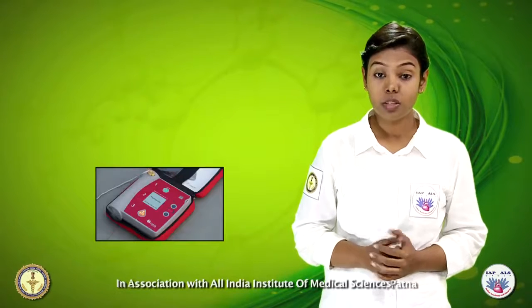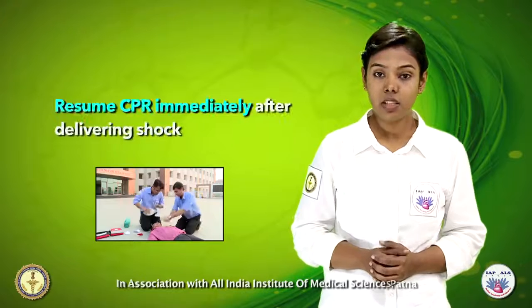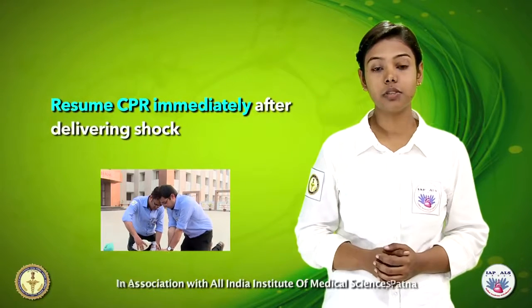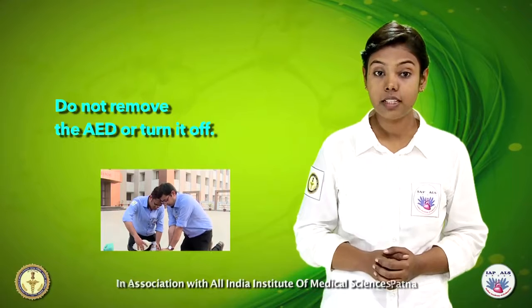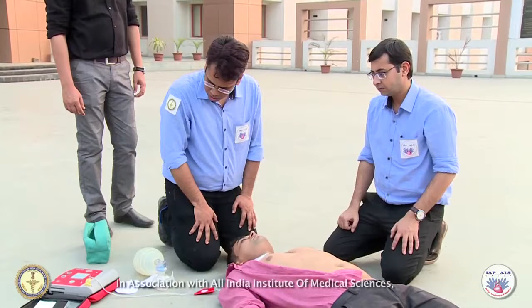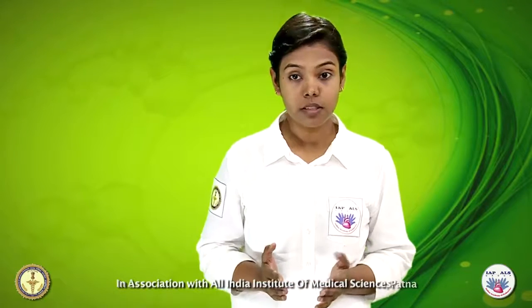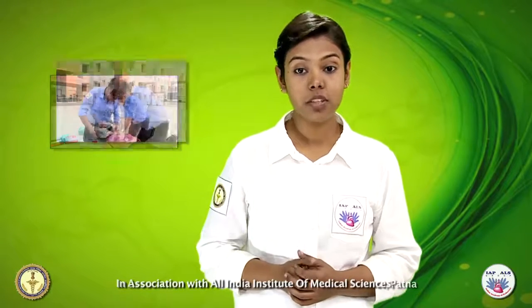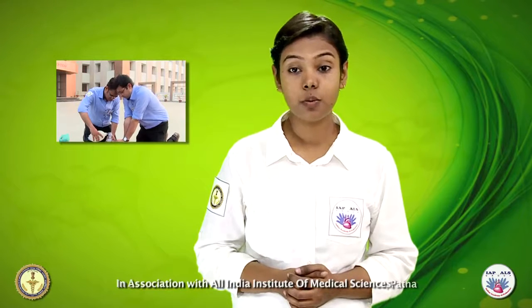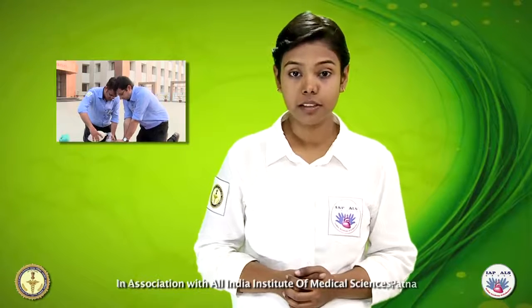The shock will produce a sudden contraction of the victim's muscles. Immediately after delivering the shock, resume CPR starting with chest compressions. You should not remove the AED or turn it off. Analyzing heart rhythm: the AED analyzes the rhythm once every 2 minutes. If no shock is advised, resume CPR immediately, beginning with chest compressions. Continue until ALS providers take over or the victim begins to breathe, move or react.